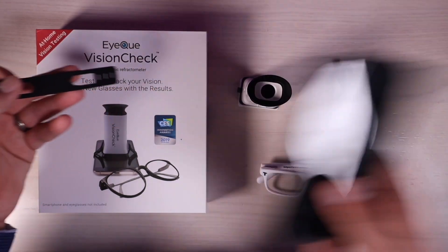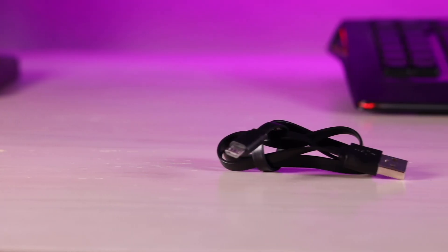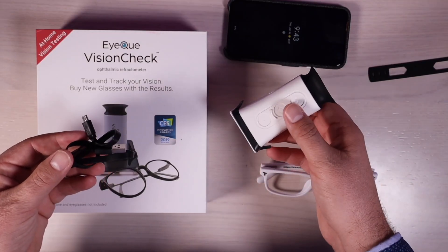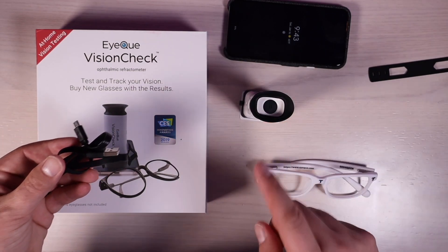This is the strap that you're going to use to connect it to your phone. You also have a charge cable that it comes with so that you can keep this charged. I've done lots and lots of tests with this and I've never had to recharge it, so the battery life on this is actually superb.